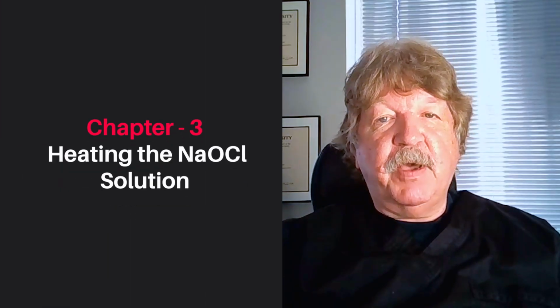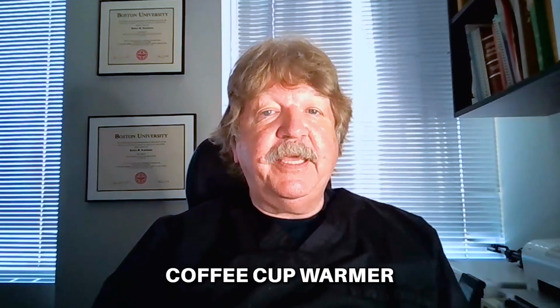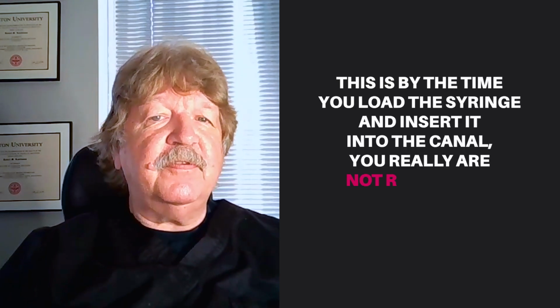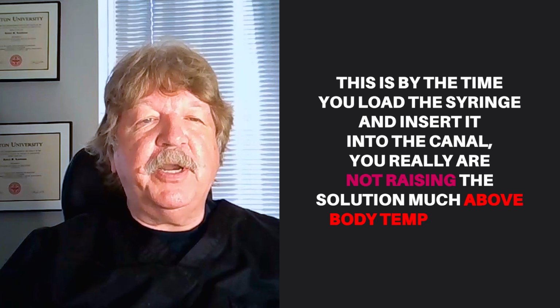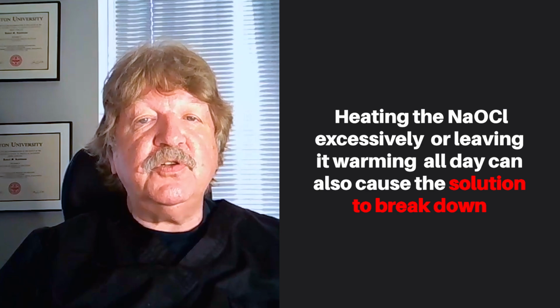Some clinicians have advocated heating the sodium hypochlorite solution. I used to do this in my practice, placing the irrigant in a container that was used with a coffee cup warmer kind of thing, where you put a coffee cup on a heating element. Problem with this is by the time you load the syringe and insert it into the canal, you're really not raising the solution much above body temperature. Heating the sodium hypochlorite excessively or leaving it warming all day can also cause the solution to break down.